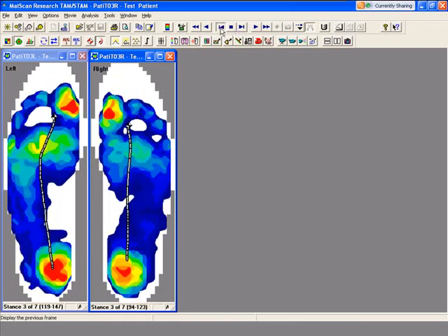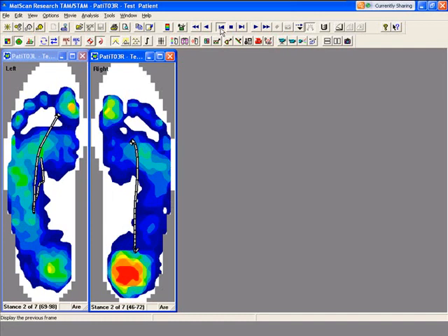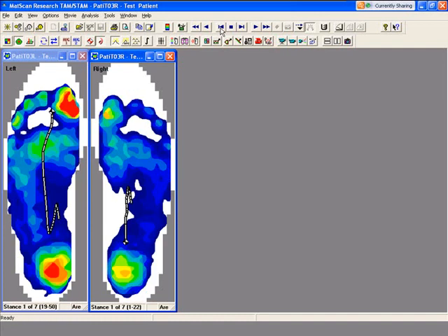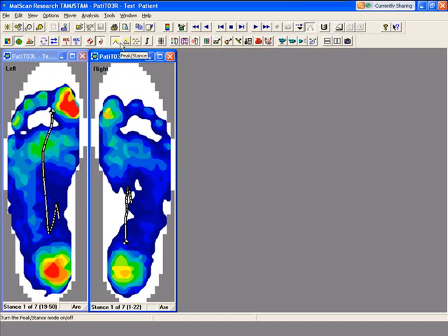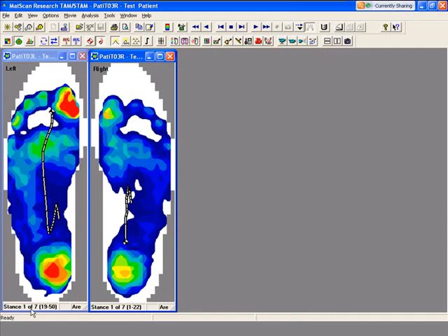The next icon is called peak stance averaging. When the subject's in peak mode, each foot strike is shown as a stance. Right here is stance 1 of 7. On the left foot we took seven foot strikes, same thing on the right foot, stances 1 through 7.